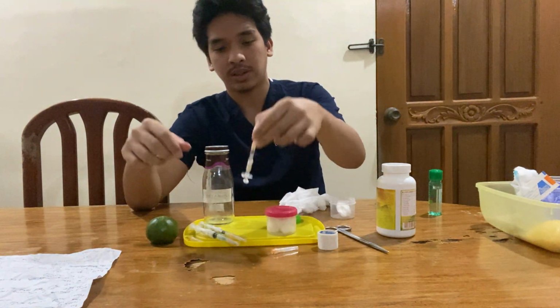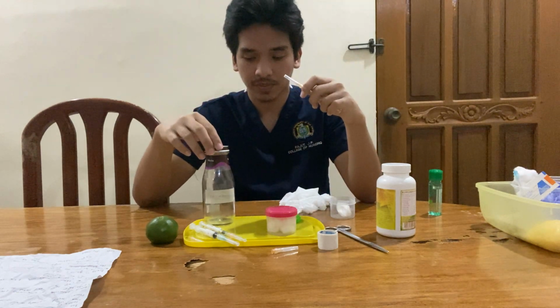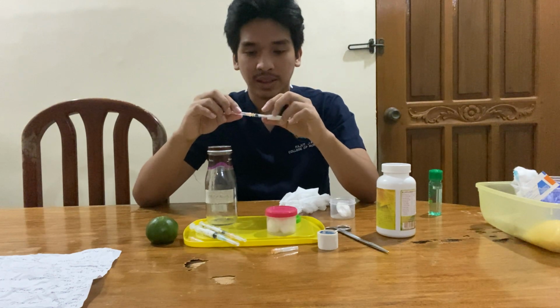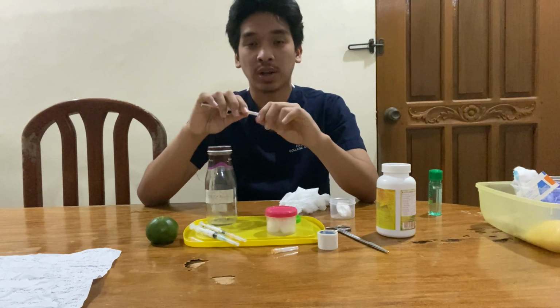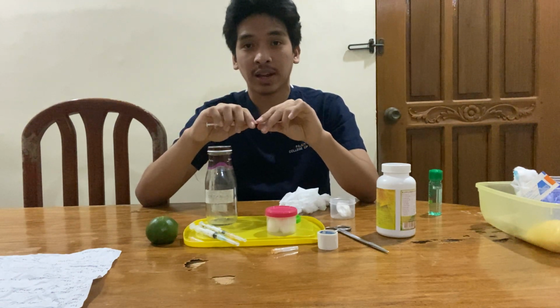Last one is the antibiotic. To do this, the doctor ordered that we will get 0.1 of the cefuroxime and 0.9 of sterile water.